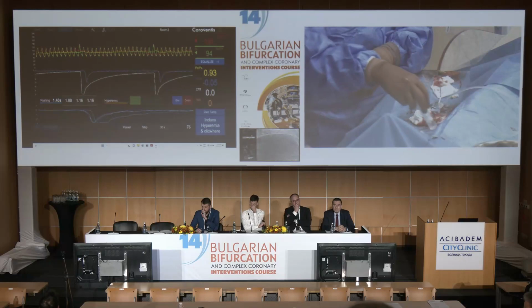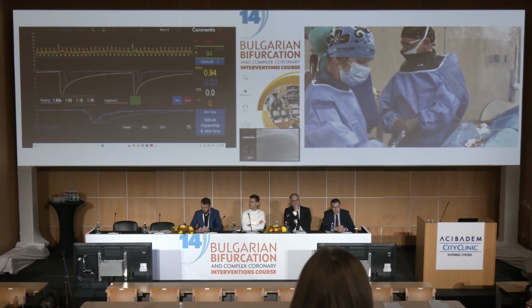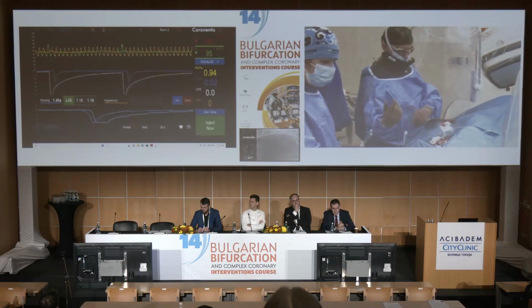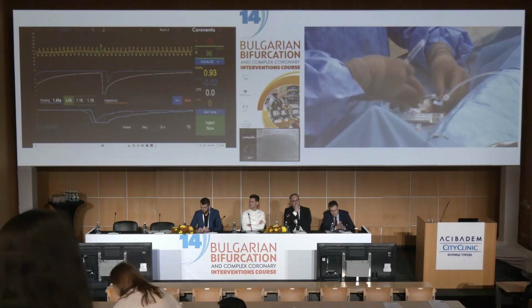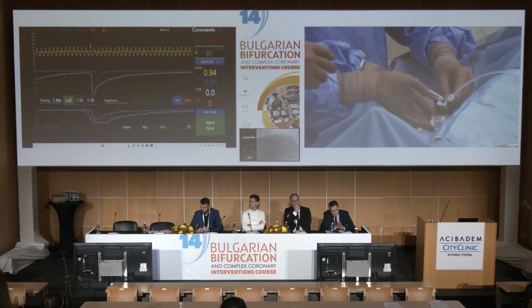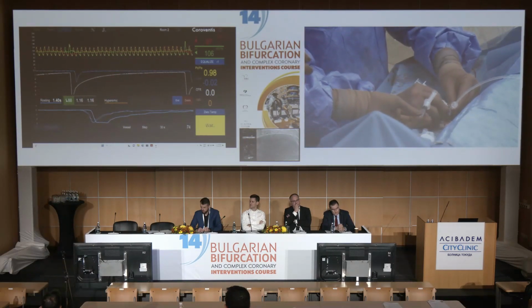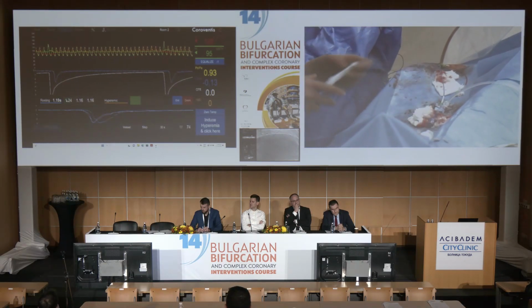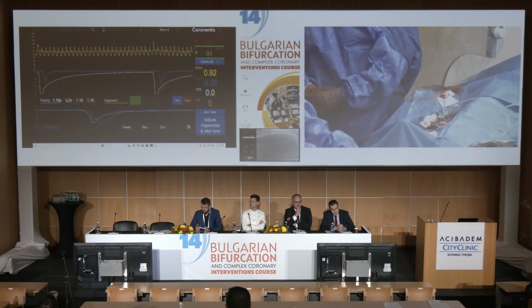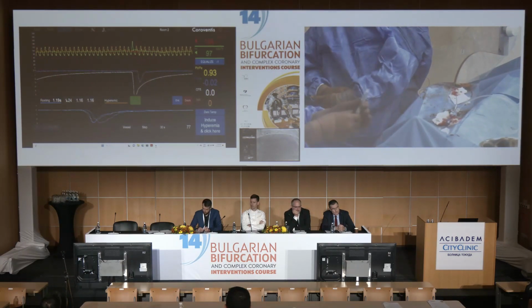188, 116, and 116. I would suggest to replace the 188 because it's really out of range. And if you have another syringe for us, you do it a third time, and we will replace the 188 by a new value. Good. So 124, 116, 116. That's very nice. We are very close to each other.